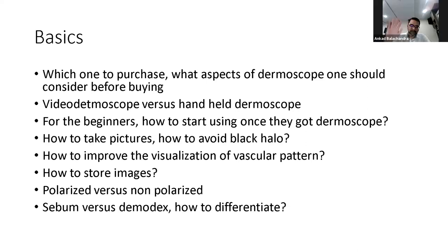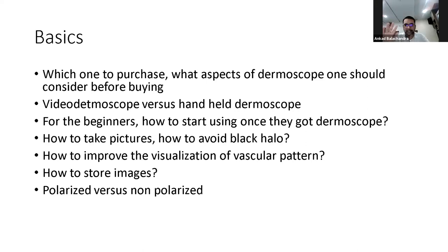Yes, I totally agree with Nikam sir. And one more thing is collagen. Collagen, most of the times, is visible only with polarized dermoscope. So non-polarized dermoscope doesn't reveal collagen. Collagen, most of the times, is revealed as white shiny streaks. So this is possible with polarized.